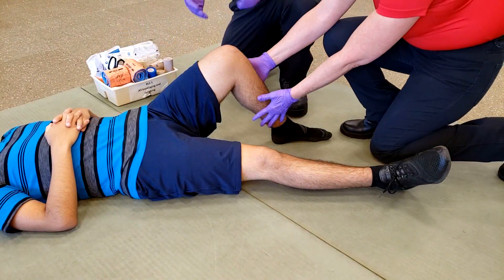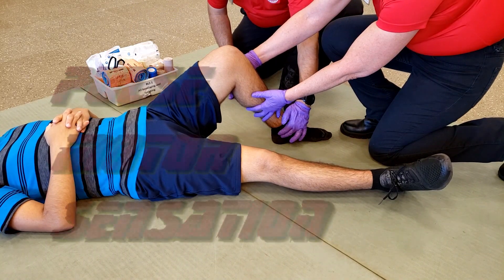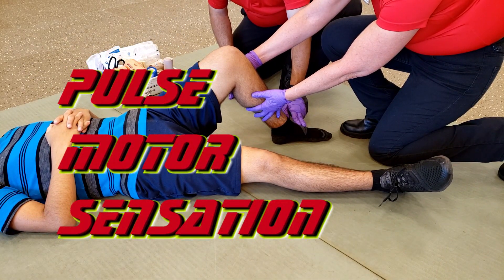To apply the Sam Splint to a knee injury, have your partner maintain manual stabilization. Check pulse, motor, and sensation distal to the injury.